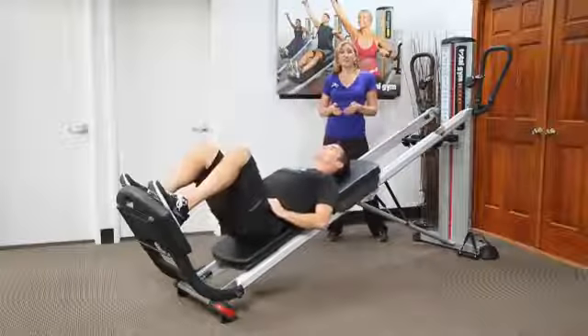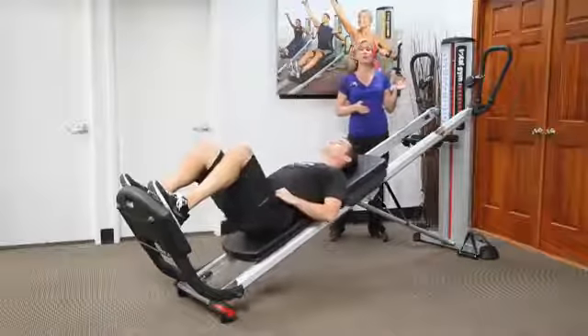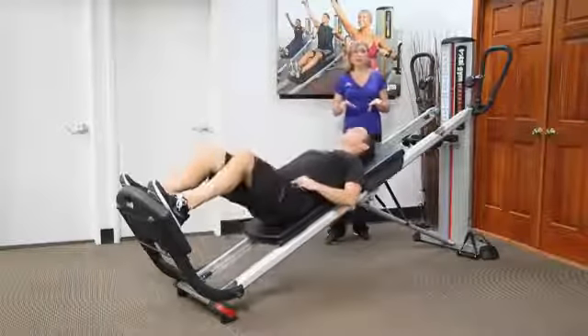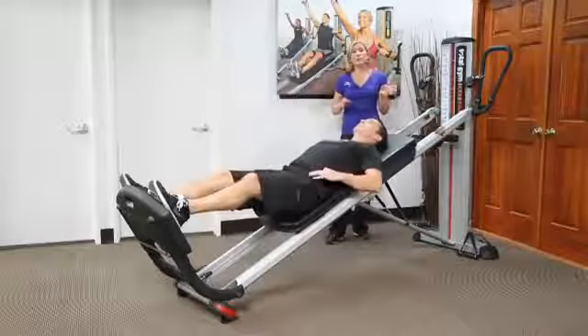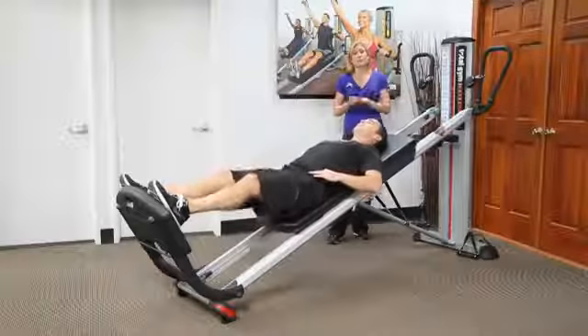Let's take a closer look at the tower in terms of strength, mobility, and awareness. We're working with the Power Tower, so when we make any incline adjustments, the patient can be on the machine. However, when you're working with the GTS or Sport, you want to have the patient get off the machine, then adjust the incline accordingly, and then have the person get back on.